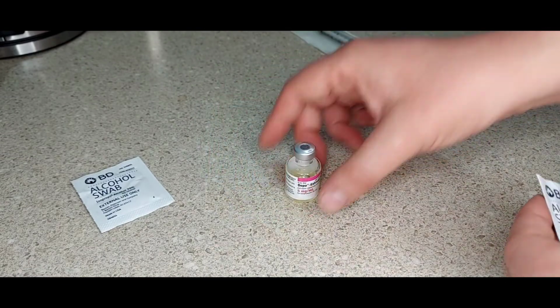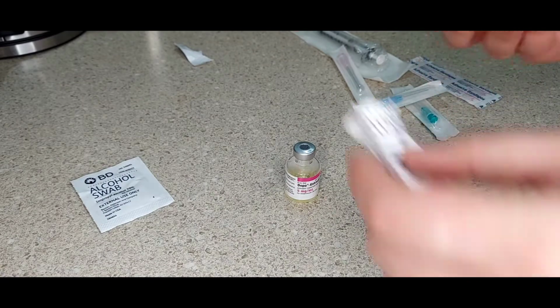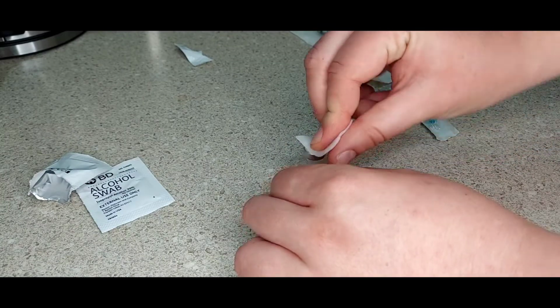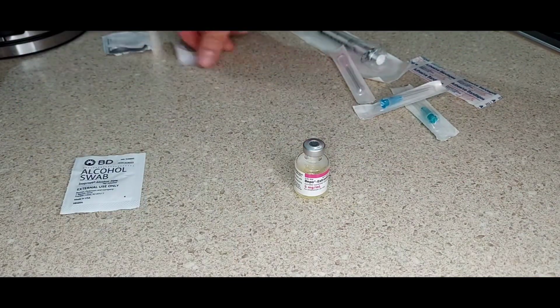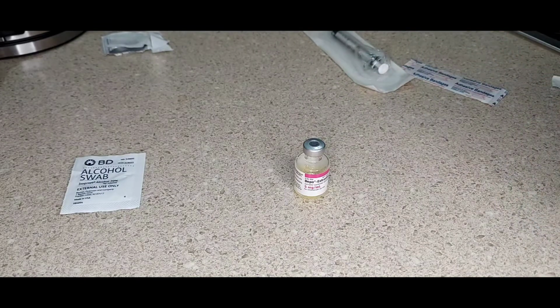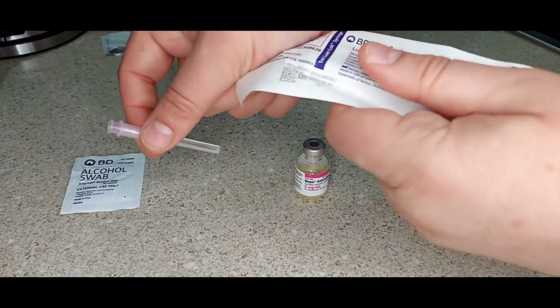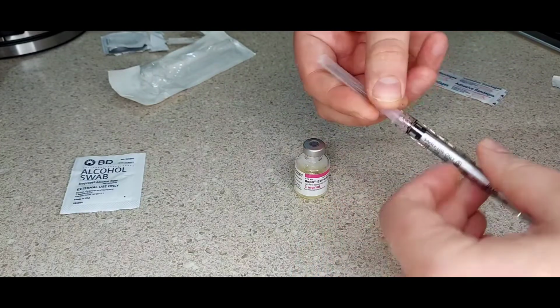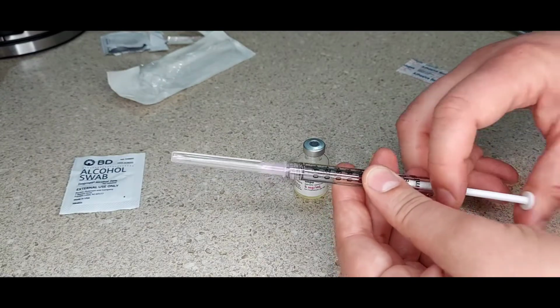Okay, so here we have, I'm going to open this up. I'm going to just real nicely swab the top of this with alcohol. Make sure that there's nothing chilling out there ready to get under my skin. Pop these open. Okay, so you want to make sure that this thing is nice and loose.